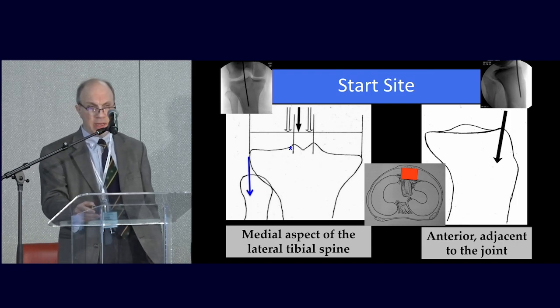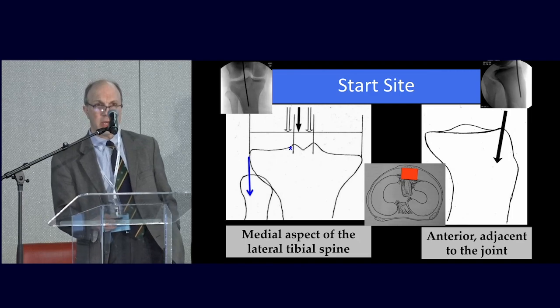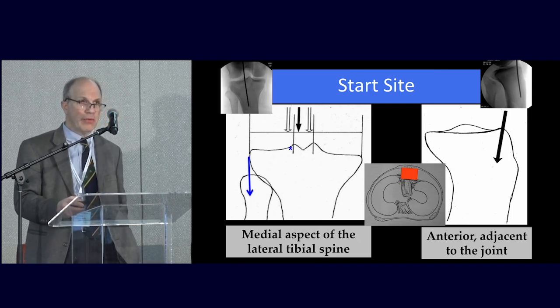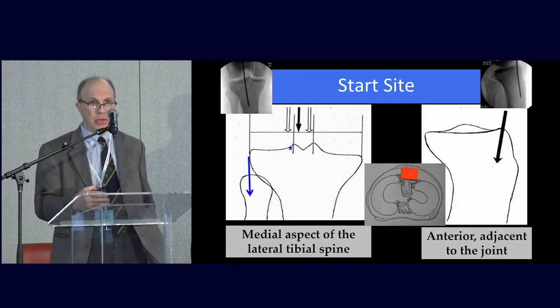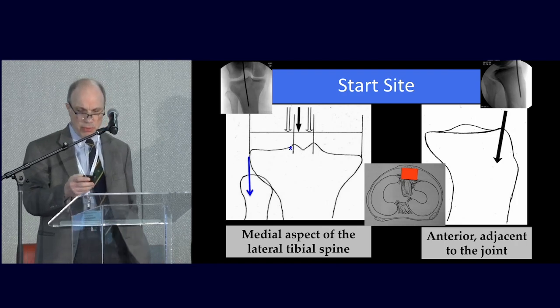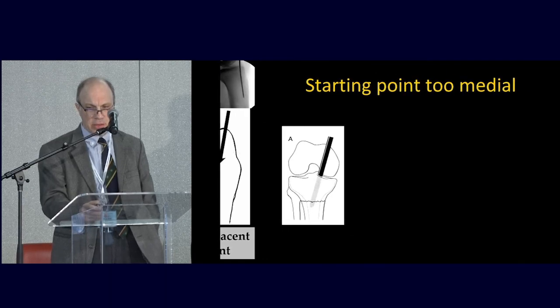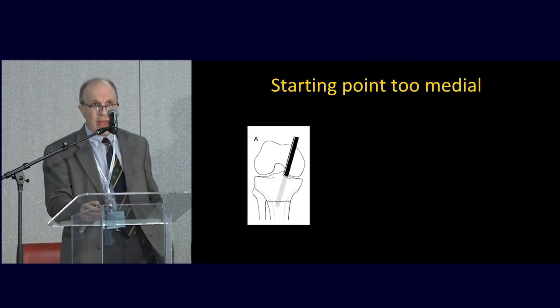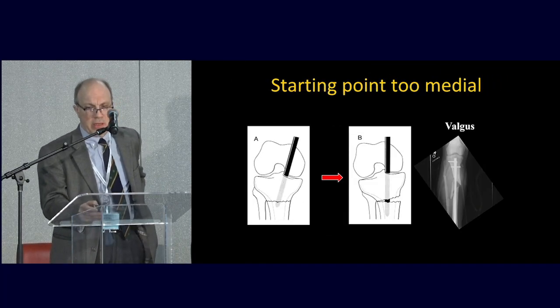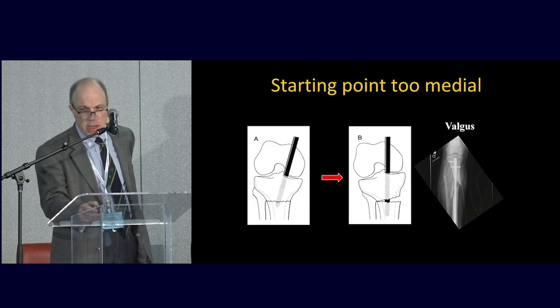Again, the start site, with every kind of nailing, whatever we do in the long bones, the start site is the most important, right? And the closer the fractures are to the metaphyseal area or the start site, the more important it becomes. And the start site for the tibia is very well described, as shown by Dr. Kretek again. What happens if your start site is too medial?